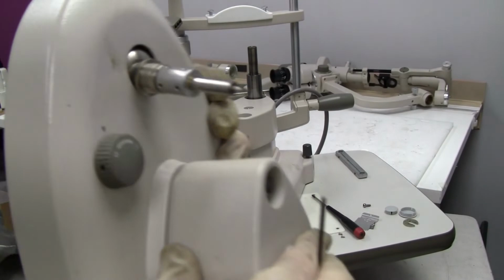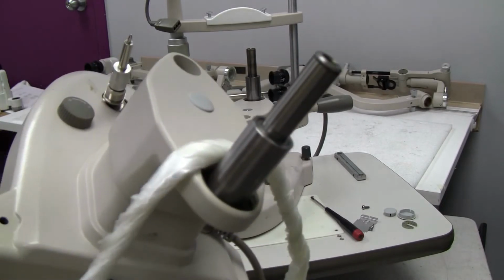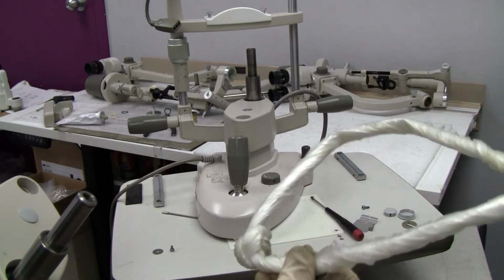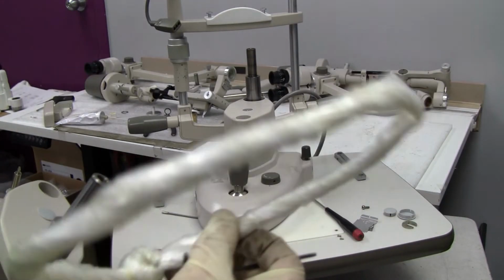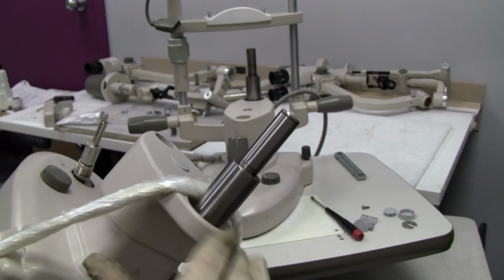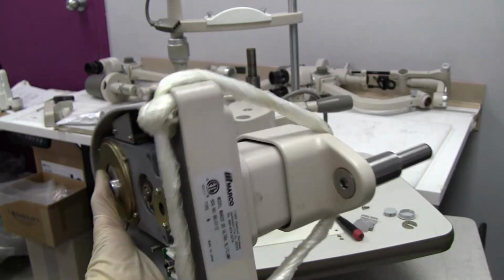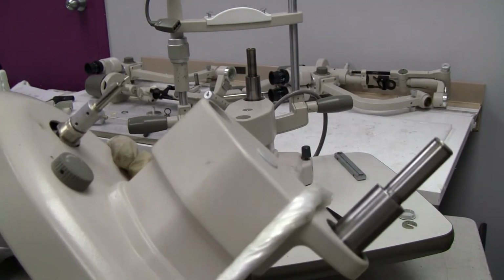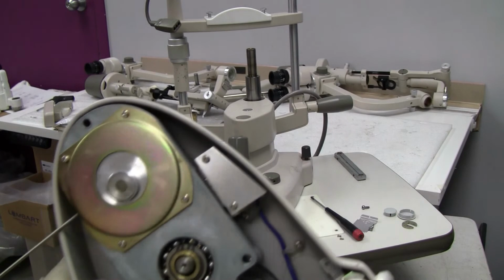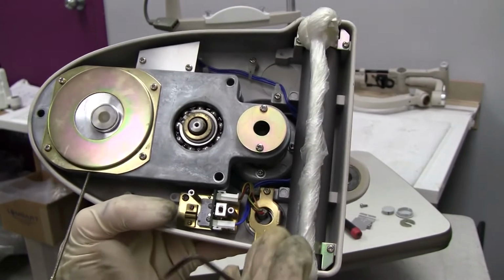Once we've taken that off, something you might want to do is get some kind of protective cover. I just wrapped a plastic trash bag in a circle, and I've wrapped it around the base, because sometimes it can come on out because of the spring. So I do that as protection. Then you have three Allens in here, 4 millimeter. You would take those out.